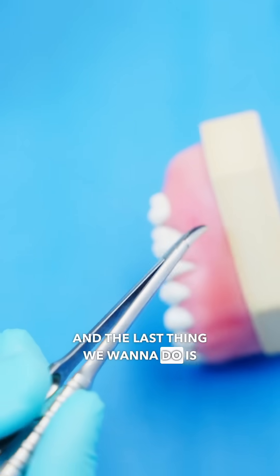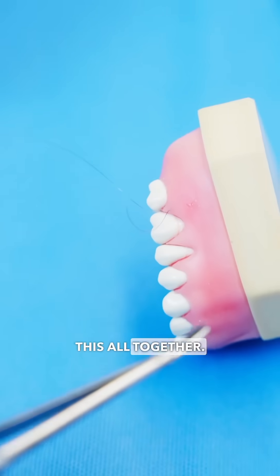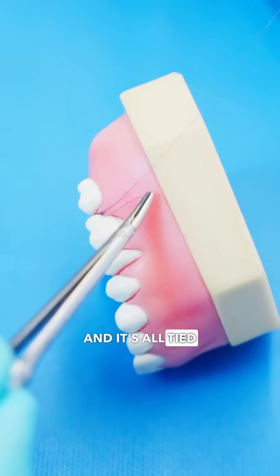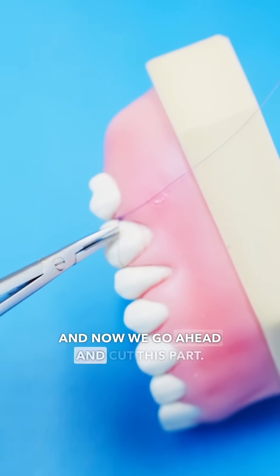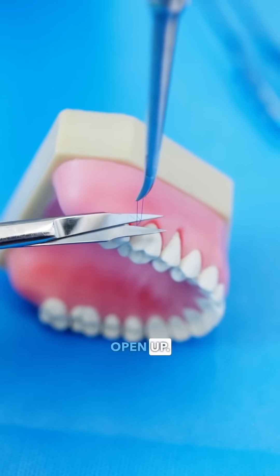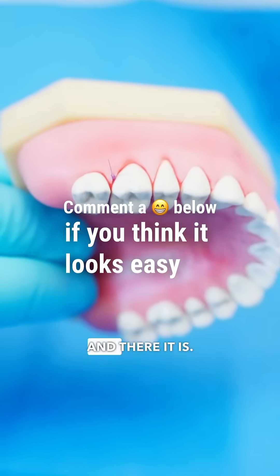The last thing we want to do is tie this all together. This is where we use what's called a surgeon's knot, and it's all tied together. Now we go ahead and cut this part — you want to leave about two or three millimeters so this doesn't open up. And there it is.